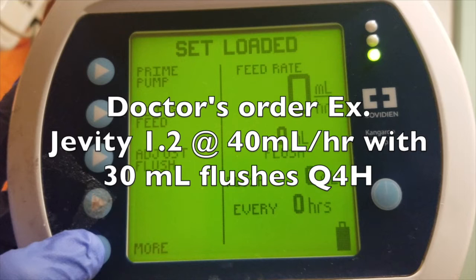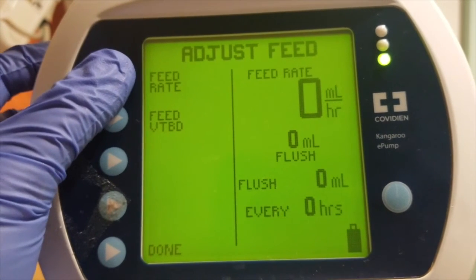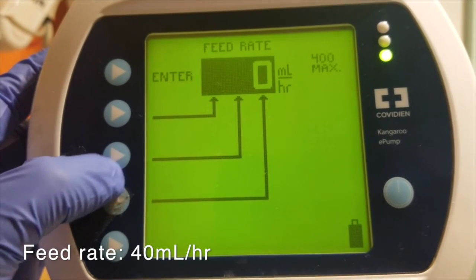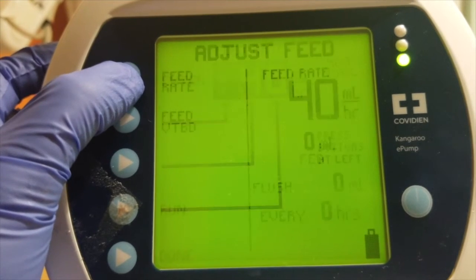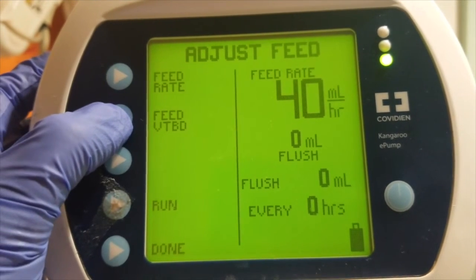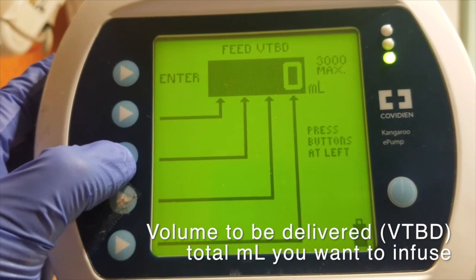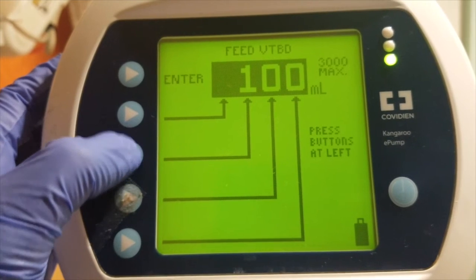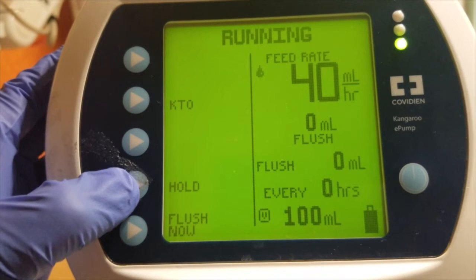Here's an example of the doctor's order: Jevity 1.2, give at 40 mls per hour with 30 mls flush every 4 hours. Press adjust feed, then feed rate, and put in the appropriate rate ordered by the doctor — in this video it will be 40 mls per hour. Now press the button that says feed VTBD, volume to be delivered, and put in the total volume of the formula bottle. I'm personally putting in 100 because I want the pump to beep and remind me to come back and change my patient's rate. Press run. You are now done programming your feeding rate.